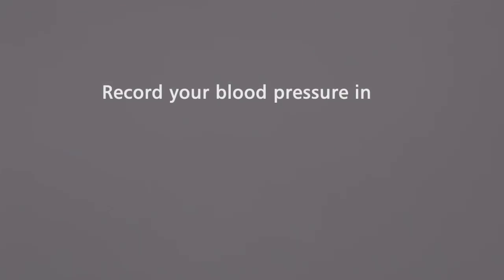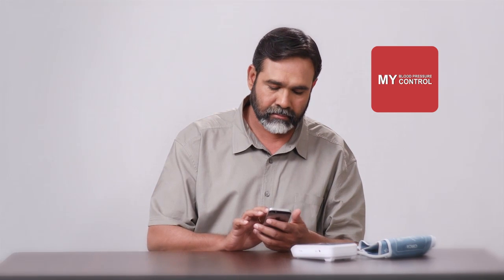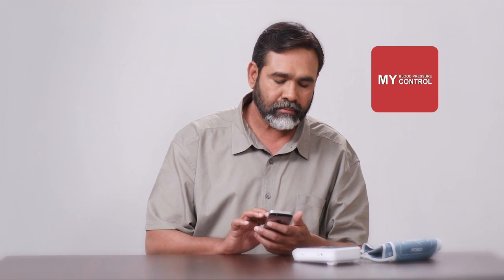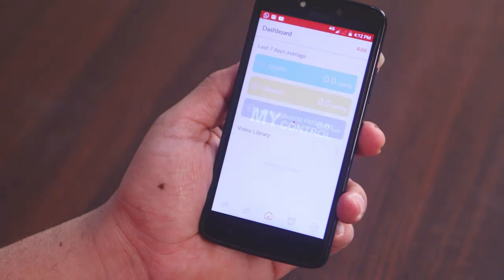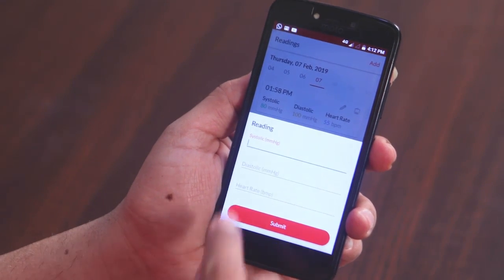Record your blood pressure in the My Blood Pressure My Control application. Open the application using the serial number shared. Serial numbers are mentioned in the welcome booklet — verify the same at the time of purchase. Once you have taken your blood pressure, open the application and press the Enter New Data button.